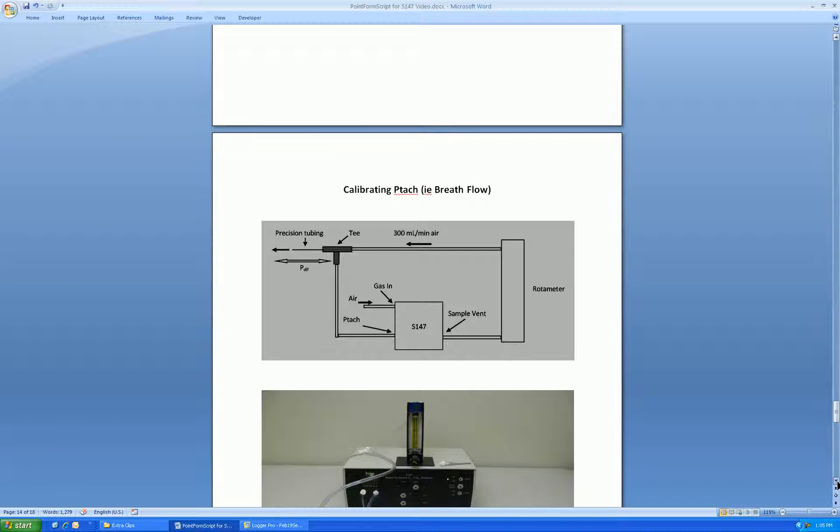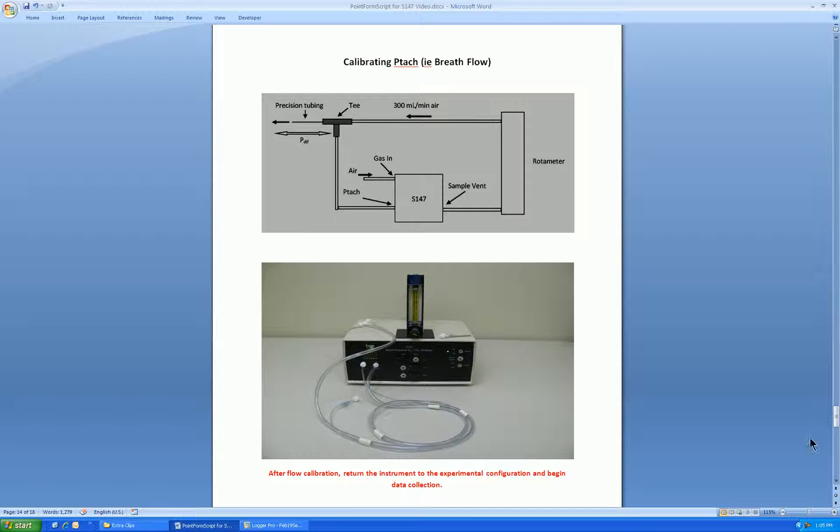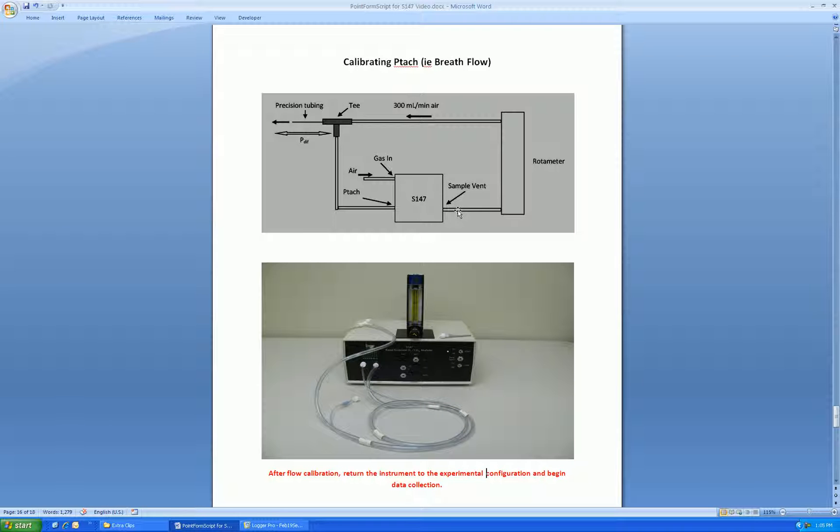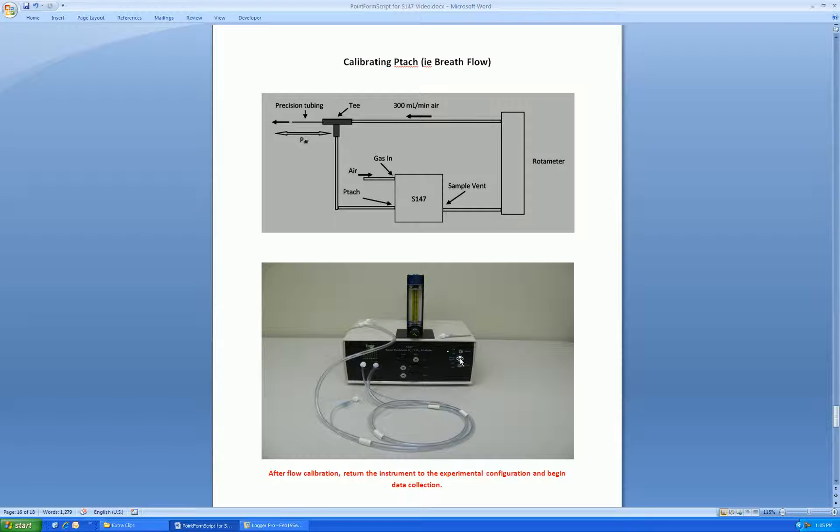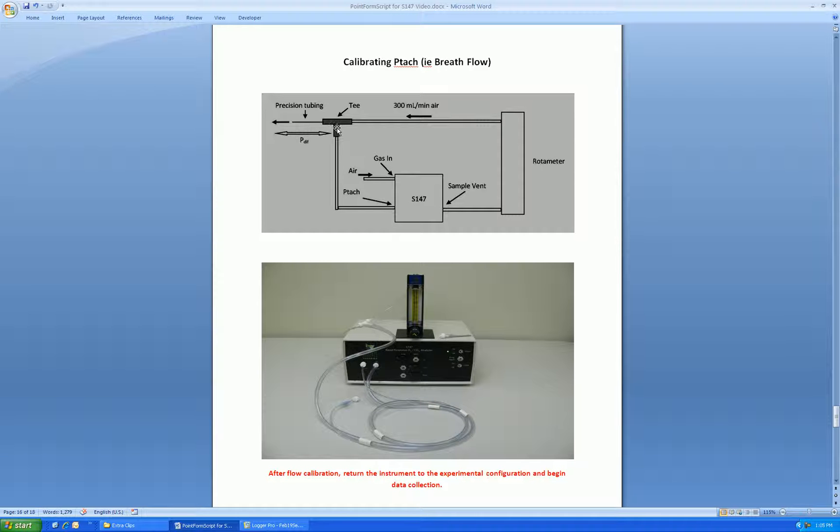So here is the setup for calibrating flow. We use the sample exhaust as a convenient means of a fixed flow, ensuring that the flow is 300 mils per minute. If not, adjust the pump speed to obtain 300 mils per minute on the rotometer. Use that 300 mils per minute into the supplied T with the precision tubing to create a small differential pressure across the tubing. The bottom of the T is connected to the PTAC tube, the large tube, and connected to the S147 to measure that differential pressure, and thereby calibrate.